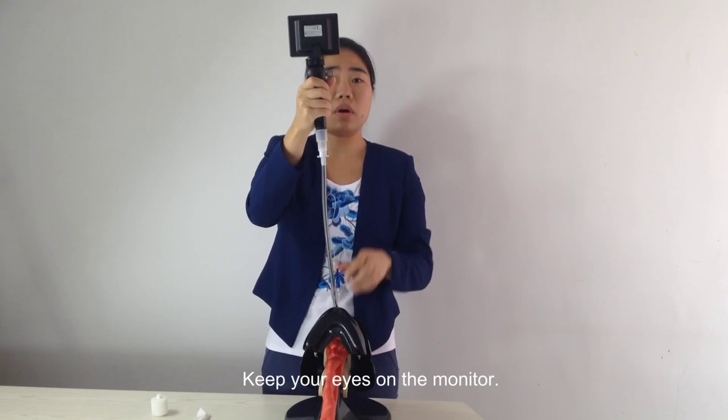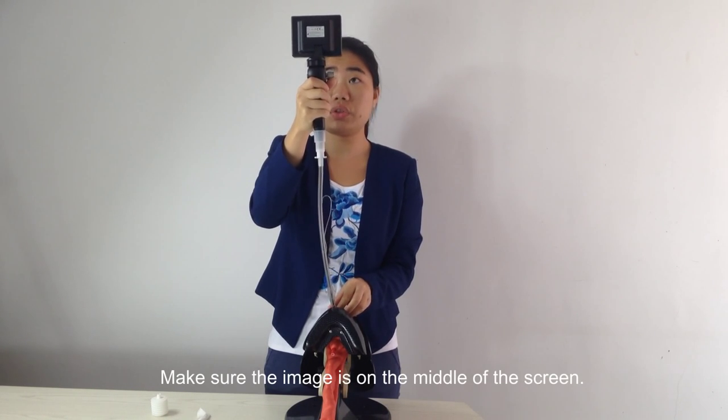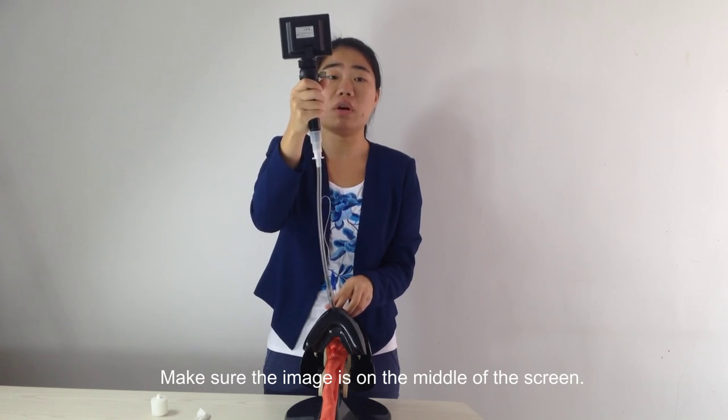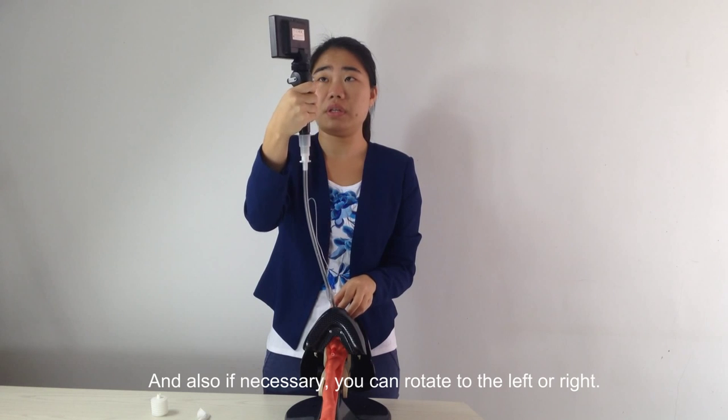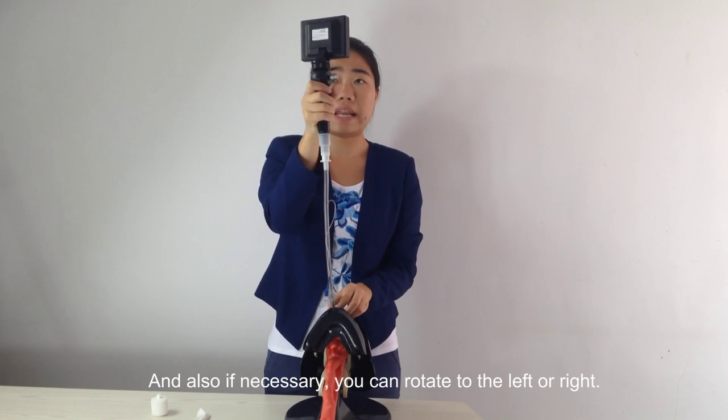Keep your eyes on the monitor. Make sure the image is in the middle of the screen. If necessary, you can rotate the tube to the left or right.